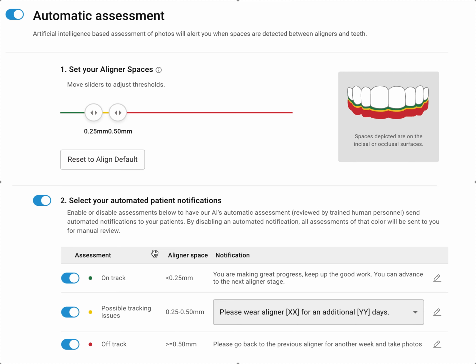And certainly, honestly, if they're not checking in, well, they're not getting more aligners. I mean, they have to do what they're supposed to do. That's part of the agreement. And the patient's agreeing to this as well. That's part of the whole agreement. They're going to be part of the virtual care program. Certainly, if the patient has concerns, let them in the chair. Let them come in. But they don't need to be coming in every 3 to 4 weeks. All right, just no need.